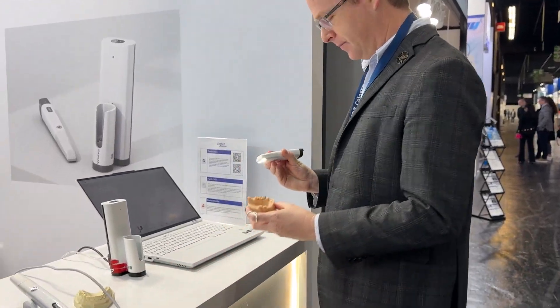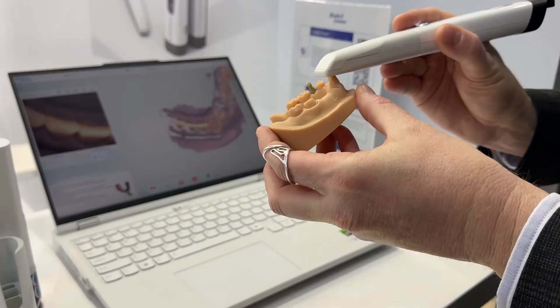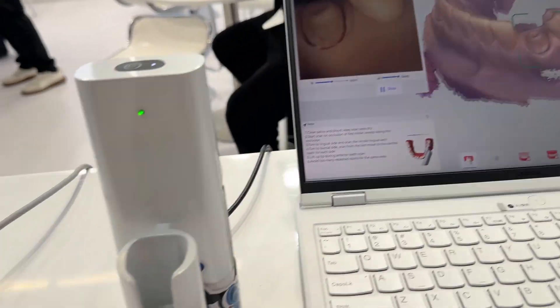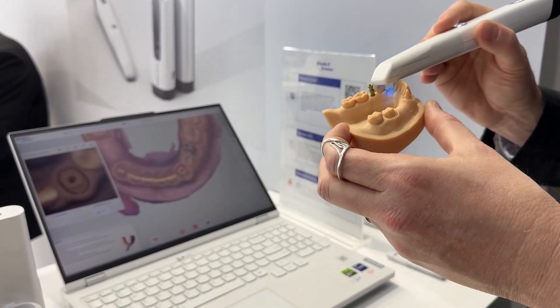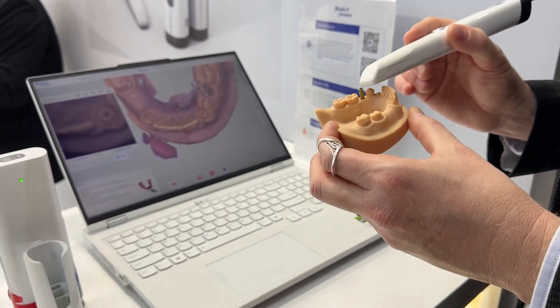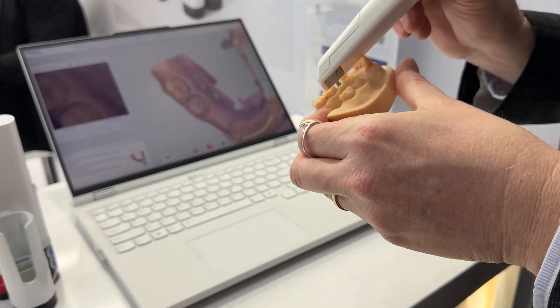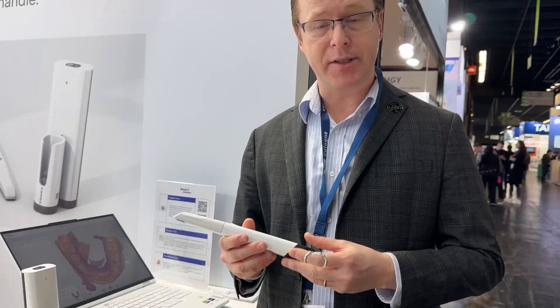Let's go ahead and try scanning. On the scanner I can also control the depth of the scan — there's a slider icon right here if I wanted to make it shallower or deeper. In this example we have a cast post and core, and I'm capturing margins. Overall, my very first impression is a very impressive scanner. Very light.